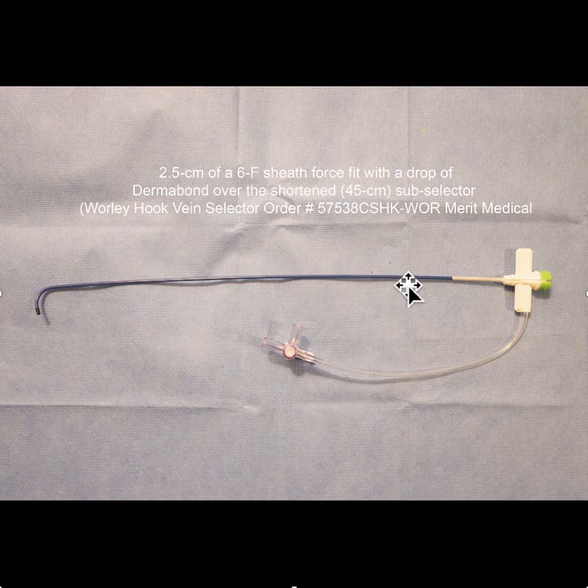Now, if you're trying to use a standard size lead, you could use one of the 9 French LVIs and modify it using a larger hemostatic valve after you cut off the 9 French version of the LVI.